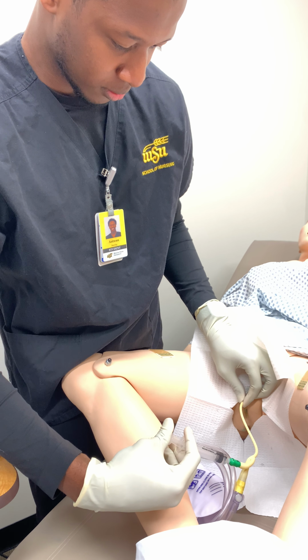So after that, I'll make sure to install the stat lock, and I'll do that by placing it on the inner thigh, because here we are dealing with a female patient. Installing the stat lock there, I will remove my drape as well.